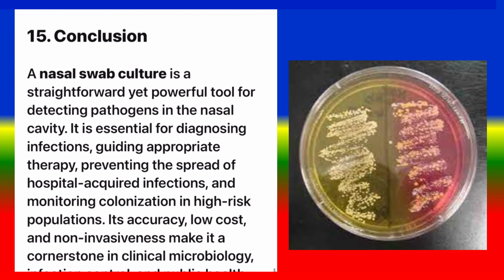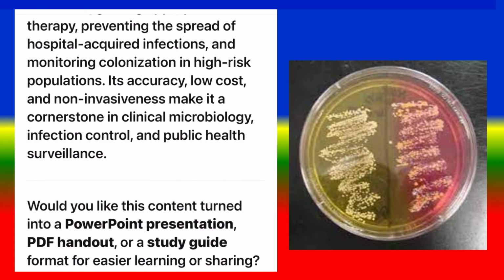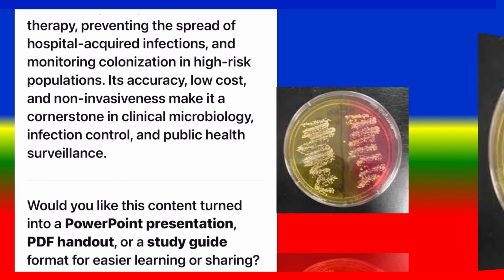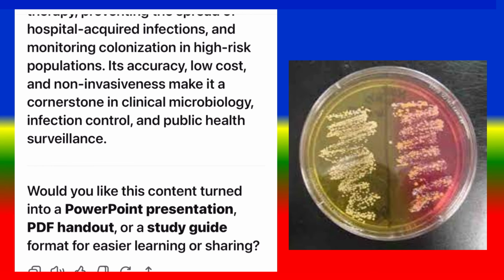15. Conclusion. A nasal swab culture is a straightforward yet powerful tool for detecting pathogens in the nasal cavity. It is essential for diagnosing infections, guiding appropriate therapy, preventing the spread of hospital-acquired infections, and monitoring colonization in high-risk populations. Its accuracy, low cost, and non-invasiveness make it a cornerstone in clinical microbiology, infection control, and public health surveillance.